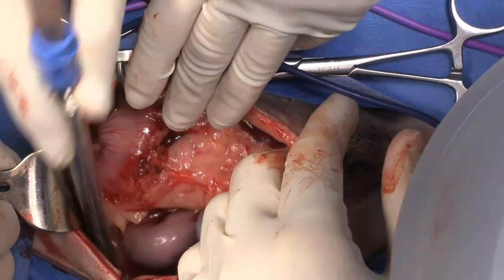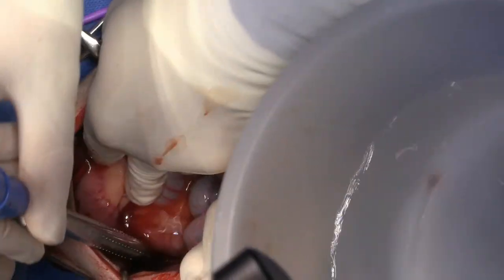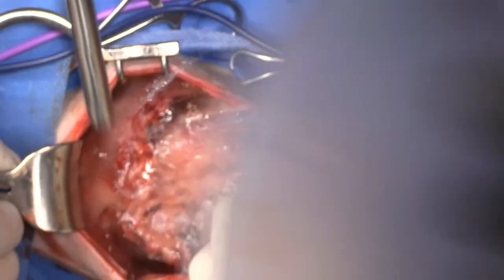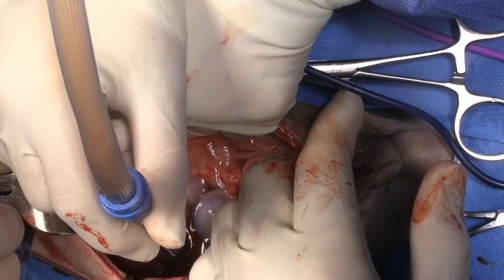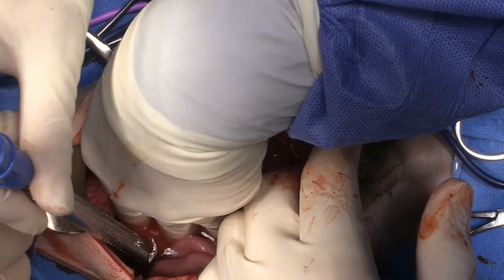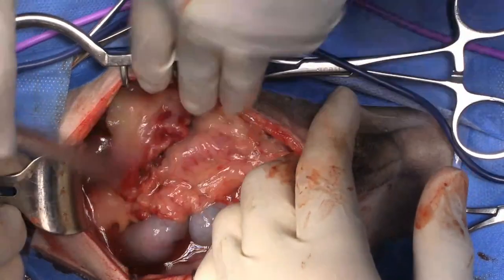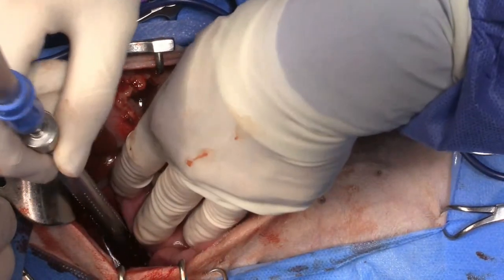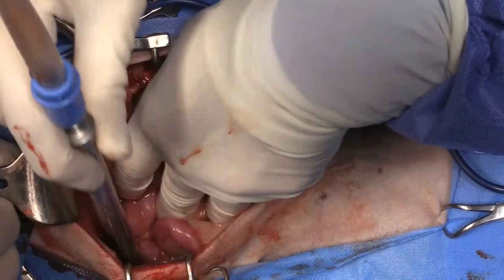And there's a question about, is there a benefit about doing a cholecystocentesis prior to resection? Not if we know we're going to take it out, and there's no real justification to keep the gallbladder in unless we're concerned about trying to reroute the biliary tree by doing a cholecystoduodenostomy. But in this case, because the gallbladder is so diseased, we know we're going to have to take it out. There's no benefit in doing a cholecystocentesis. Can you slide down and let me just see if I've got any more?